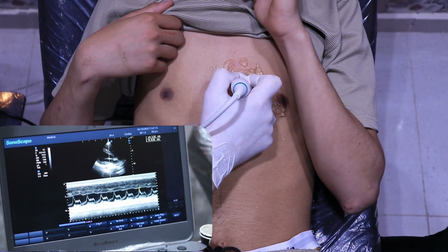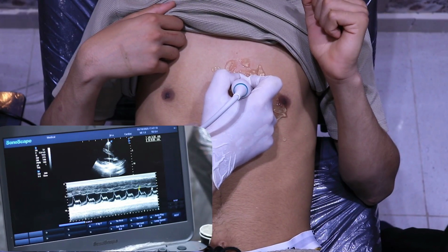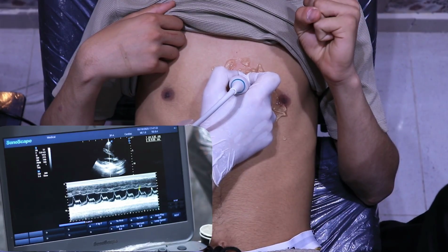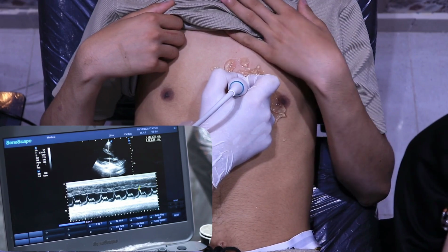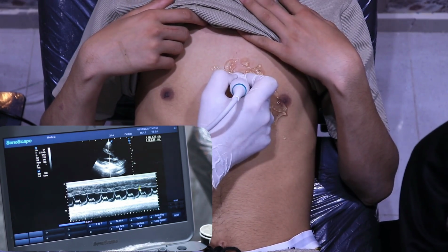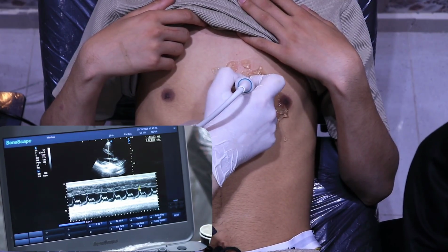So this is the widest point between the E point and the septum, which is called EPSS. Have you heard of EPSS? This is the EPSS. So this is the E point septal separation. This is an assessment of the left ventricular function. We will talk about it in detail in the left ventricle part. 6 millimeters. 6 millimeters. Yes.